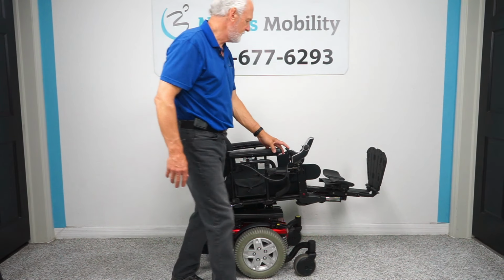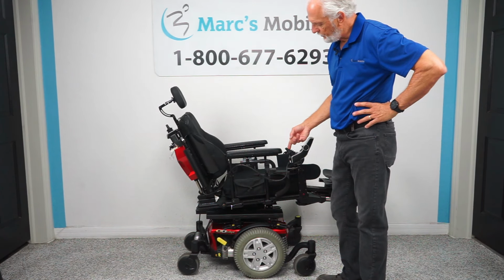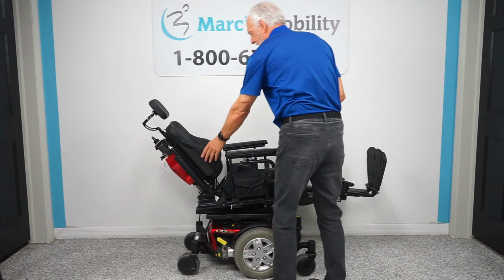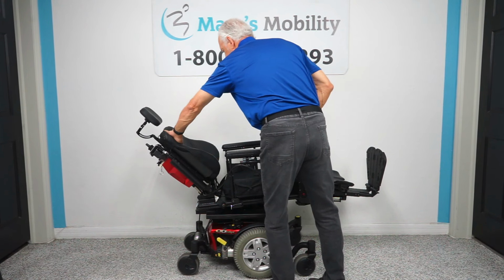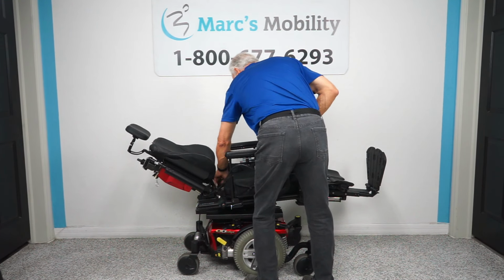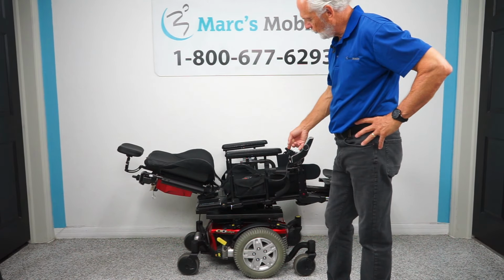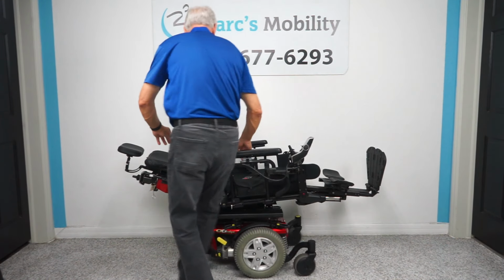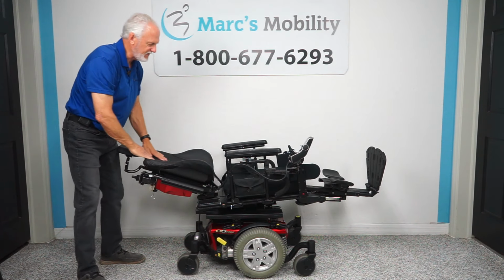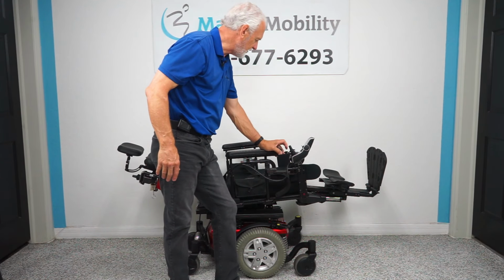And now what I'm going to do now is I'm going to do just the back yellow. Now the back is yellow. And you can see I'm pushing the joystick back. And there goes your back. Now the reason I don't want to change the seat on this chair, it has a wing back, right? This is a really expensive back, and I want to keep that with this chair. So you can see this is a full recline, pretty much. If you're laying in this chair, you can see how this would keep you in the middle of the seat. This is a really nice setup for someone who needs just tilt, recline, and legs.